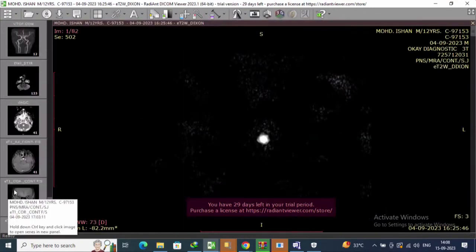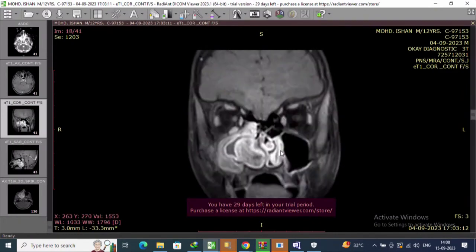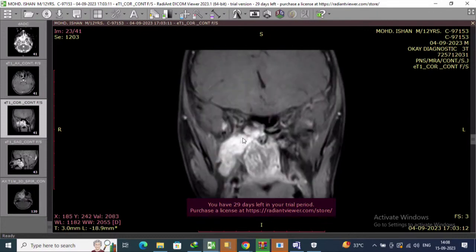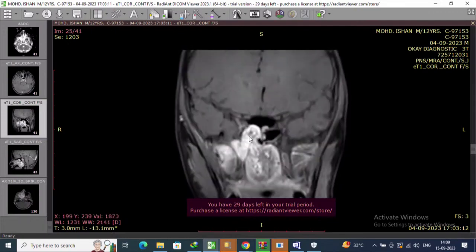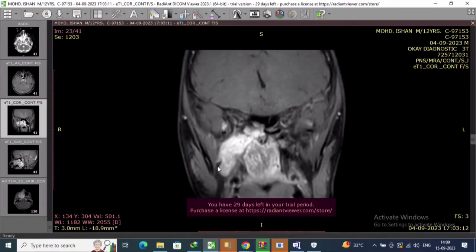Now, coming to the MRI, certain important features on MRI. Quickly, see, this is the tumor which is like a pot coming anteriorly. That's the tumor going behind in the infratemporal fossa. See how the tumor is going down in the infratemporal fossa, right to the level of the palate. We have to pull it out. And looking at the big mass, this is tumor occupying the pterygoid fossa, projecting into the sphenoid. This is the posterolateral projection. This is the anterolateral projection.